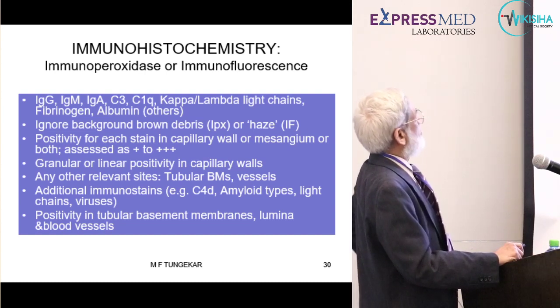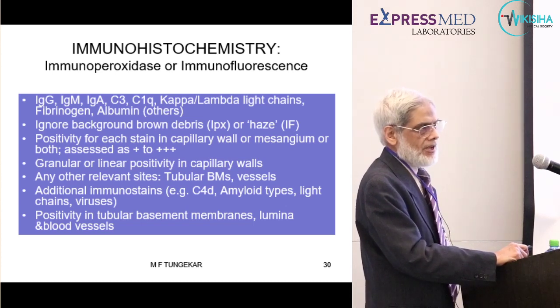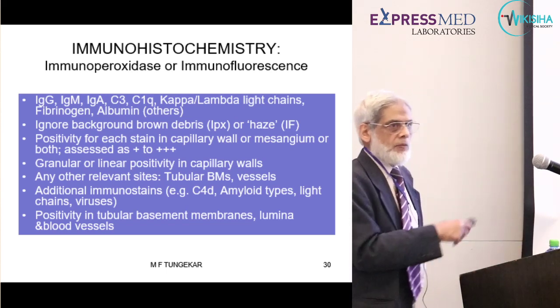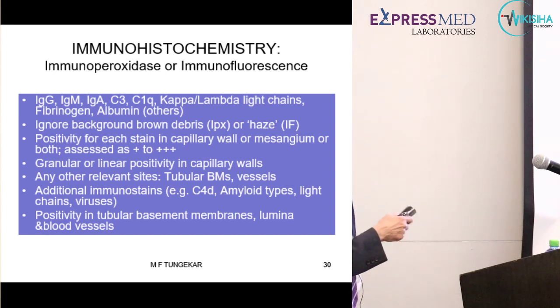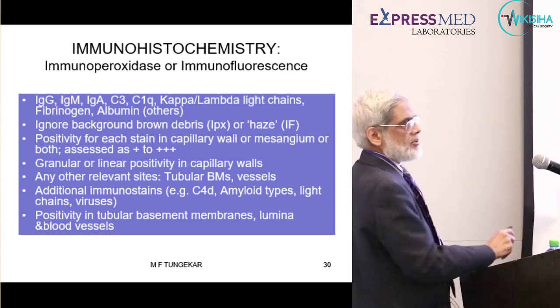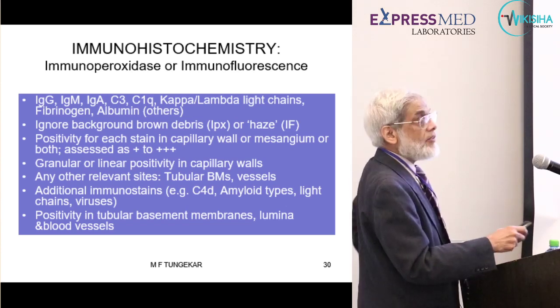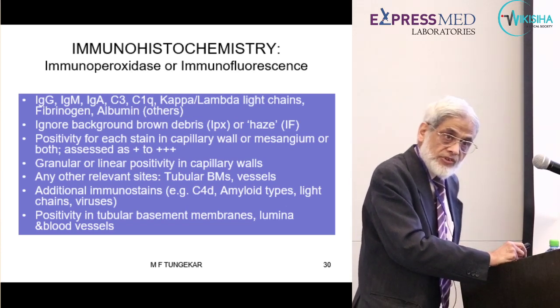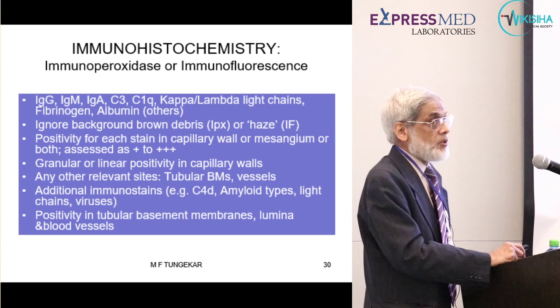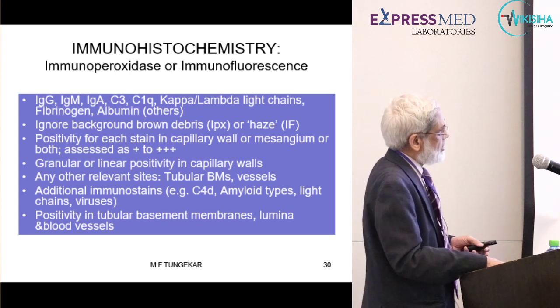The disadvantage of immunoperoxidase is that it's a tricky stain to do. It takes a very long time for the technicians to get familiar with it. And not all antibodies work on paraffin embedded tissues. So that's the disadvantage. The immunofluorescence advantage is that it's very quick, same day diagnosis, in a few hours you know it. Most of the antibodies will work on immunofluorescent samples, fresh samples. The disadvantage is that you don't know exactly sometimes where the positivity lies. It's all dark in the background. Everything is dark.